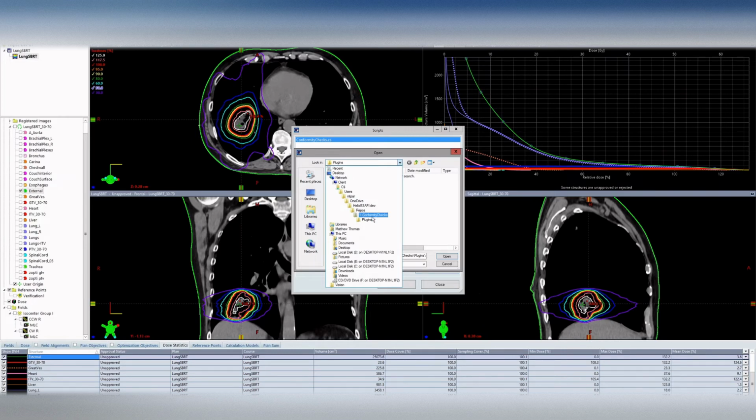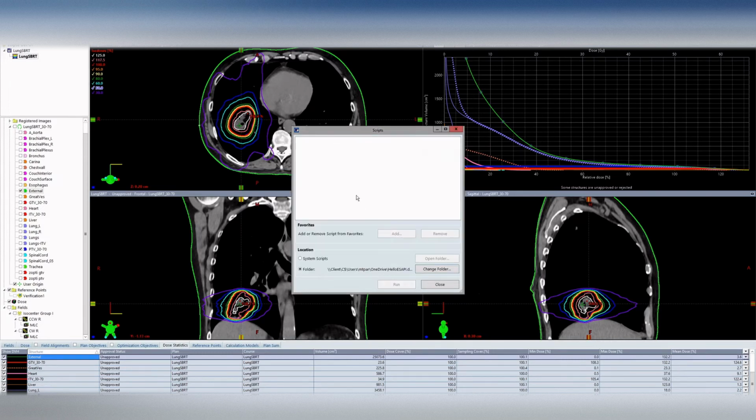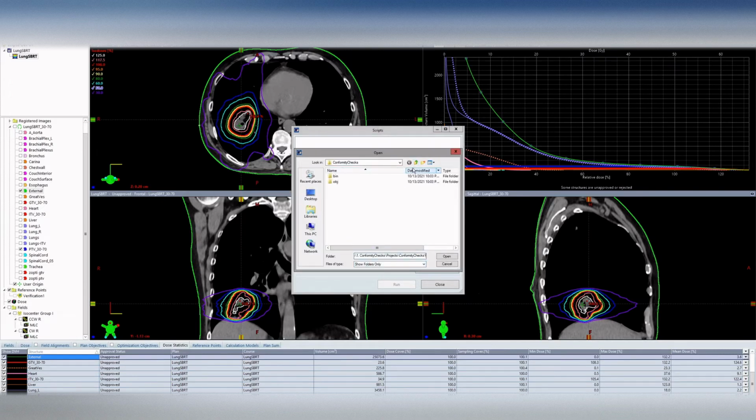So you're going to want to look in your plugins folder. If you go into the projects folder, you won't find anything, because it's looking for a CS file. It's looking for files that end in CS and files that end in esapi.dll. Sorry, my phone's vibrating. So for single file plugins, you're going to want to be in this plugins directory. We don't see anything only because down here it says show folders only. If you change to all files, you can see conformity checks.